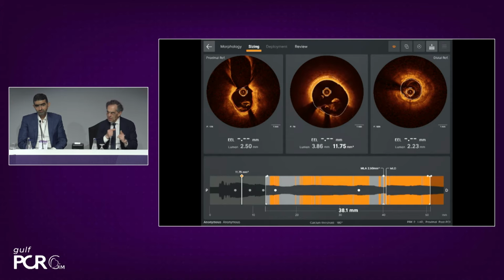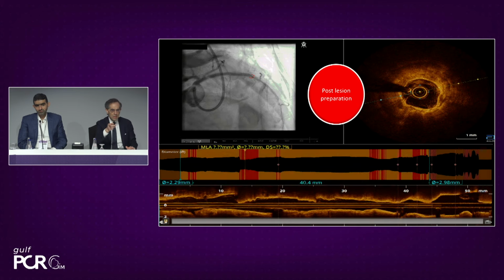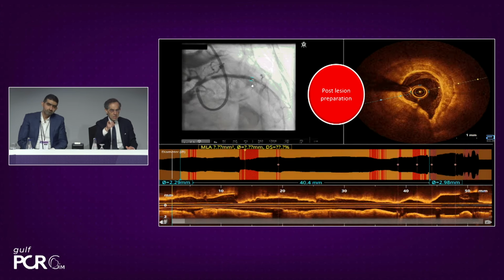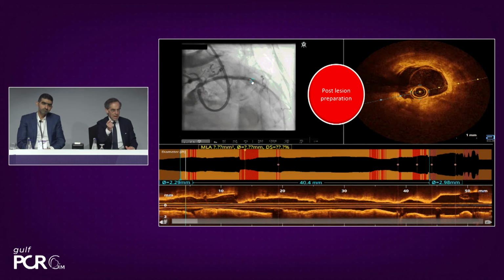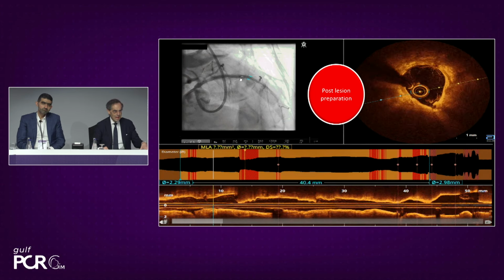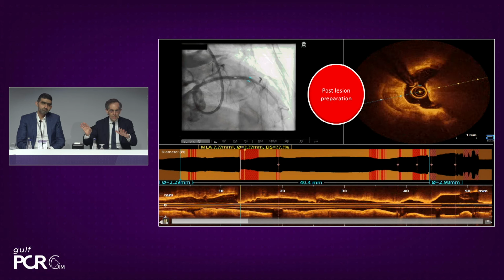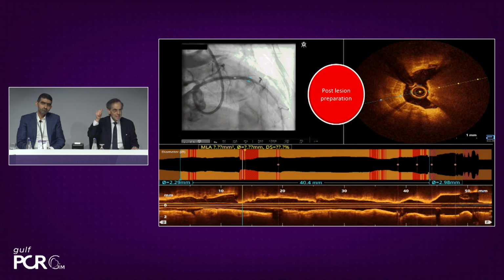Yeah. And in the previous slide, you showed that you were working with a co-registration. That is important, because here, when it's moving the video, you can see the marker coming back inside the LAD. So if you stop the video now, when there is the calcified nodule, you can see projected, displaying on your angio, exactly where this content is.